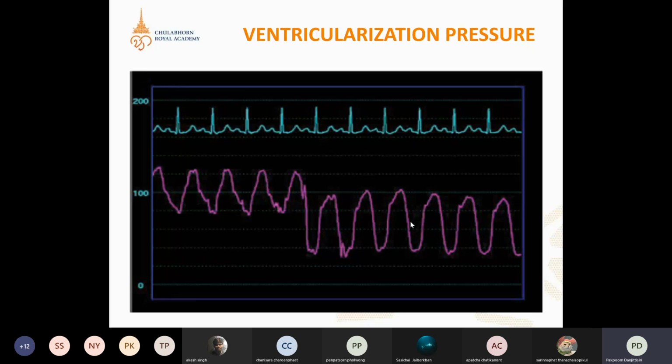the same size as the coronary vessel, and then during engagement, the catheter goes deeply inside the coronary artery and blocks the blood flow. I mean, it blocks the oxygenated blood from the aorta into the coronary artery.